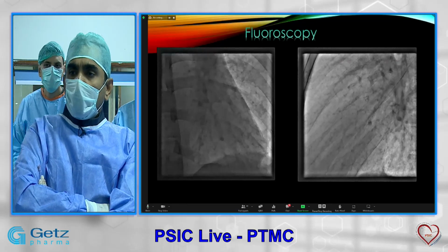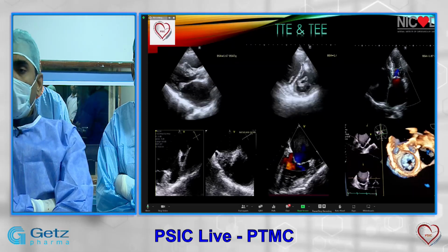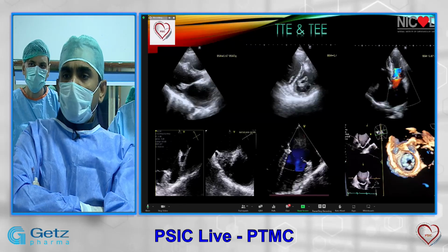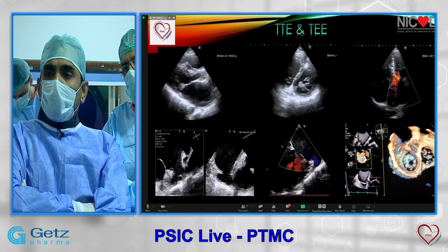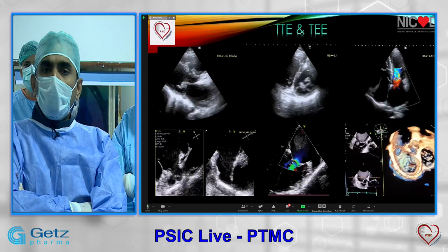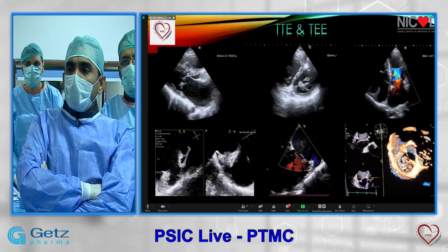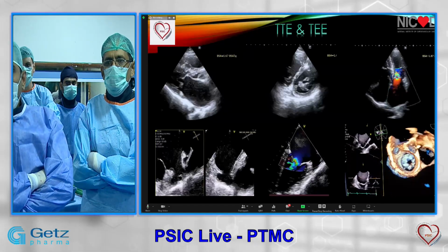Next. These are the images of the transthoracic echo and the transesophageal echo. In the upper left, you can see the parasternal long axis with doming of the anterior mitral leaflet and fixed posterior mitral leaflet. This is the second view. You can see the short axis with the fish mouth appearance of the mitral valve, the shifting of the ventricular septum, and the RV is dilated. With color, there's only minimal MR seen on the transthoracic echo.